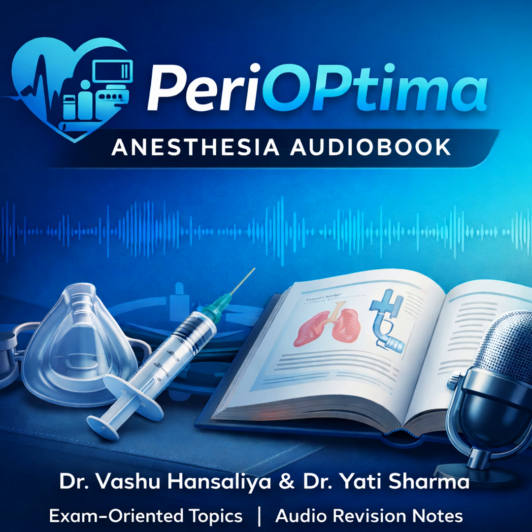Now this sounds great for resting the respiratory muscles. They just have to make a tiny effort and they get a full breath. It's excellent for that. But what about the anxious patient? Or the one with a raging metabolic acidosis who has a drive to breathe really fast. Oh, I see the problem.